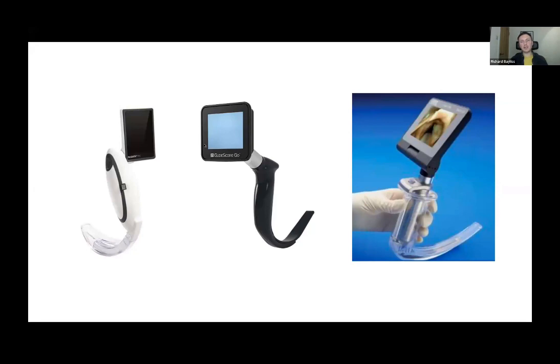One of the features of this device is that the company make bespoke stylets, which match the geometry of their hyperangulated blade, which is what's shown on the screen. That's really useful, because that should make it easier to use the hyperangulated blades, which can potentially be more tricky.